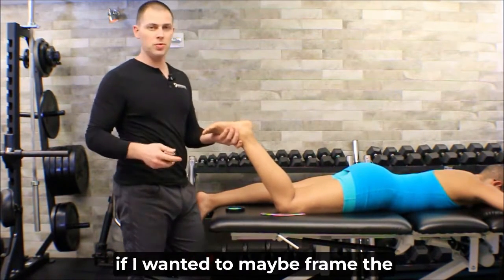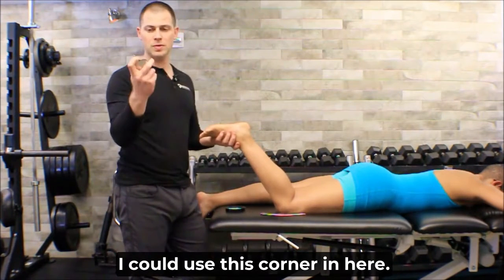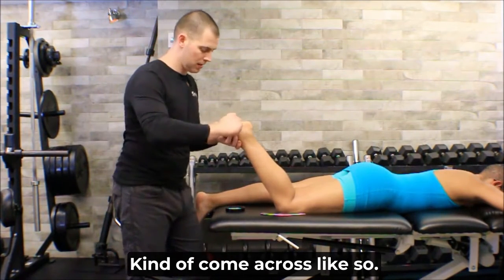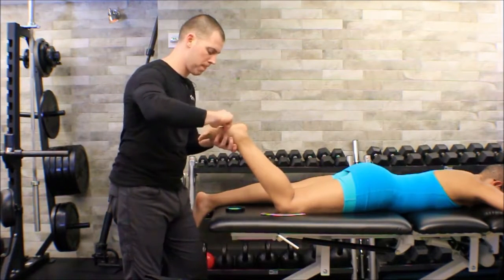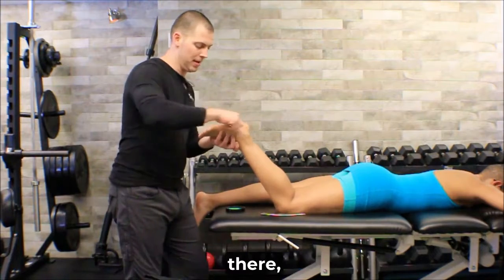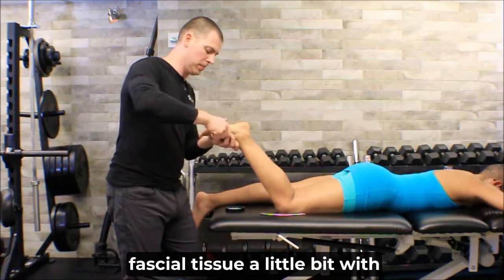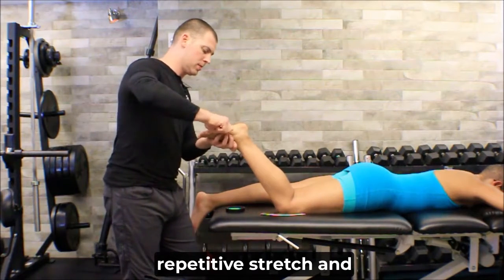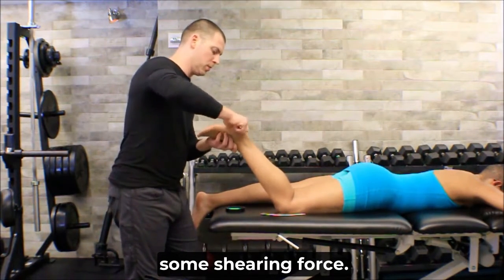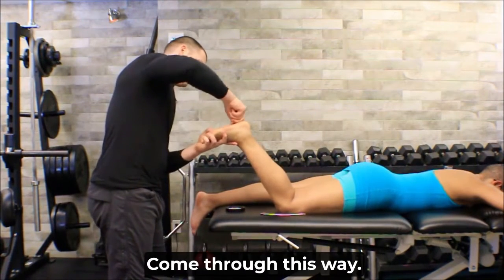Now if I wanted to maybe frame the different sides of the foot, I could use this corner in here, kind of come across like so. All right, I might not be able to go in a lot of different directions there, but at least I'm affecting that fascial tissue a little bit with repetitive stretch and some shearing force. Come through this way.